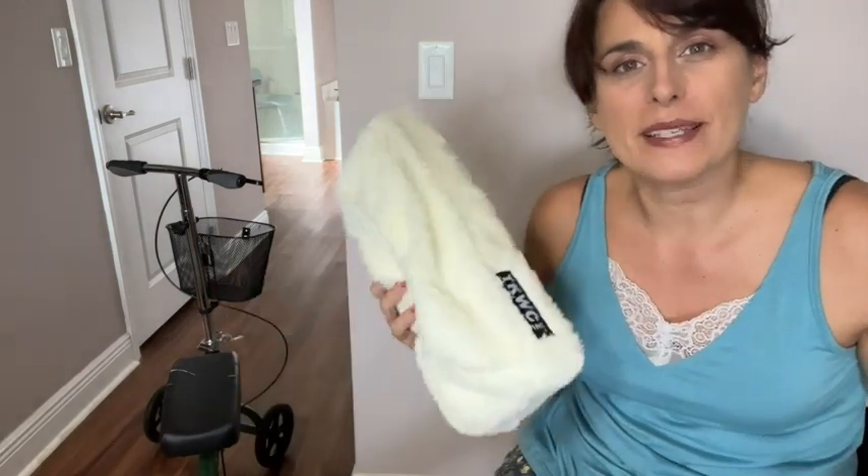Hey everyone, I'm Sarah with WTI. I was looking for a little extra cushioning when it comes to my knee scooter, and I'm really happy to say that this cushion I have from TKWC has given me that extra layer of comfort.